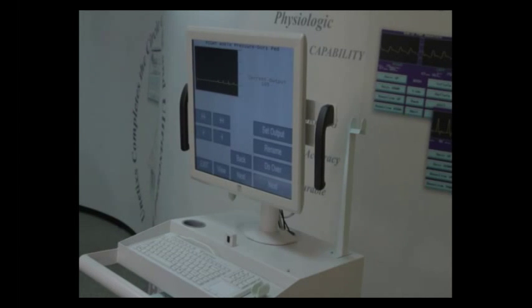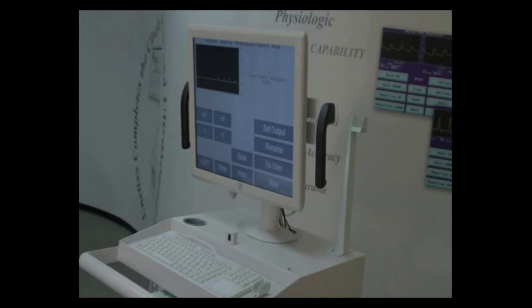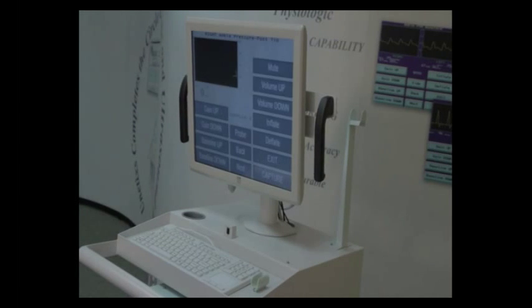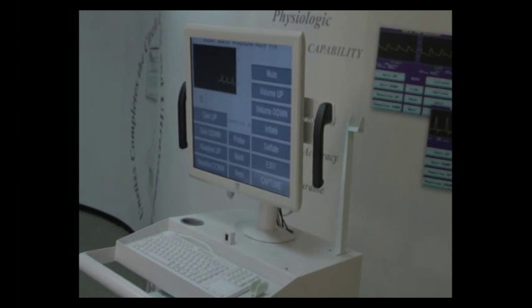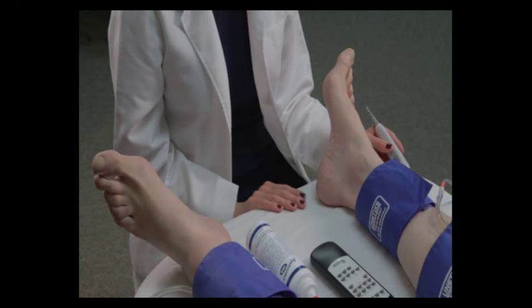That brings us to our edit screen here, where we can scroll the waveform back. We hit the capture button right at 109, and then we're going to press next. We are now being prompted to take a right ankle pressure using the posterior tibial artery.